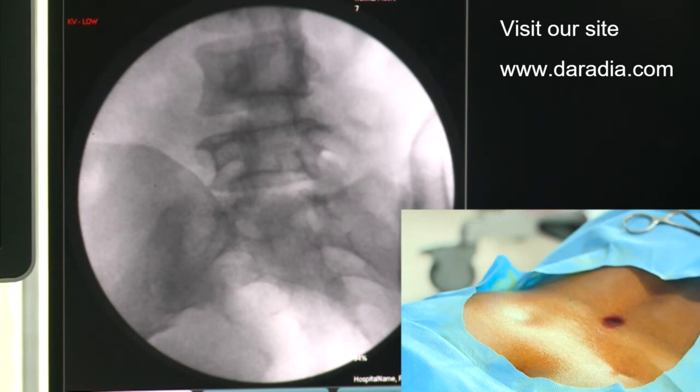So now the facet joint has nicely opened up, beautifully opened up. And you can see the L4-5 facet joint is also a little bit sclerosed.